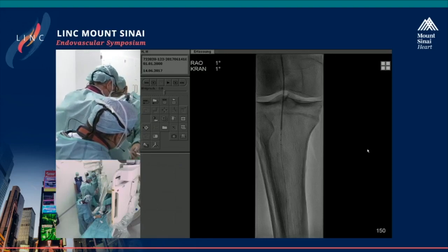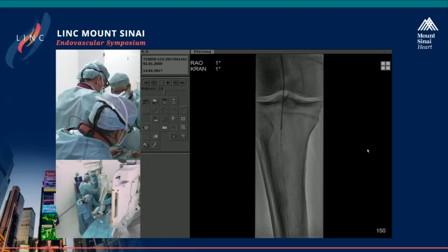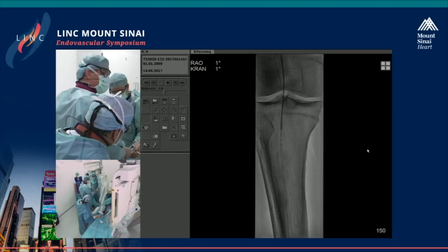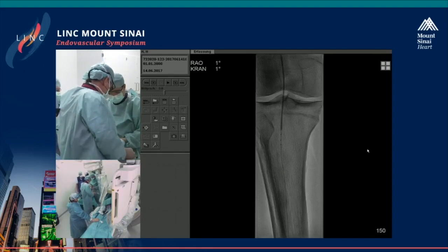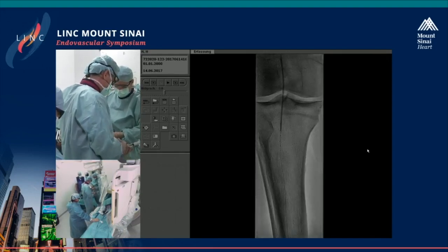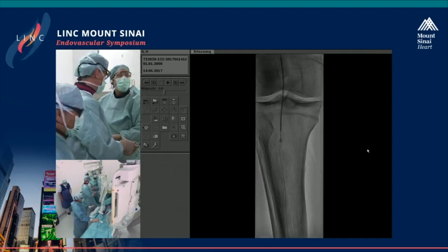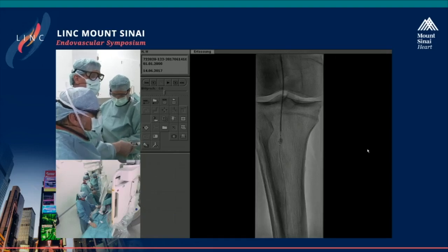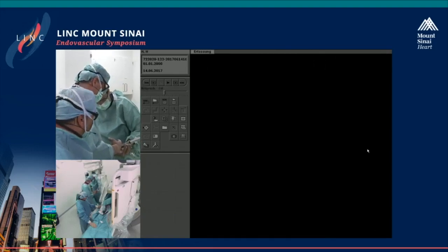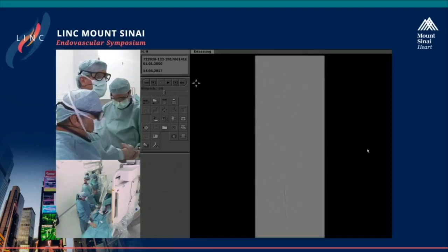Now we connect here the DEXA. So how many more injections do you think you have to do in the popliteal? Three, I would say. Okay, please inflate. So this is now the bigger one. Up to 2 atmospheres, there's a valve, so you cannot overstretch this balloon. And now I try to take the drug in.